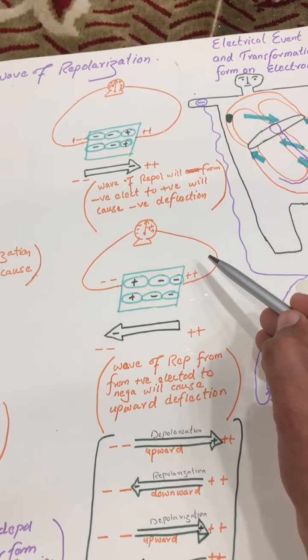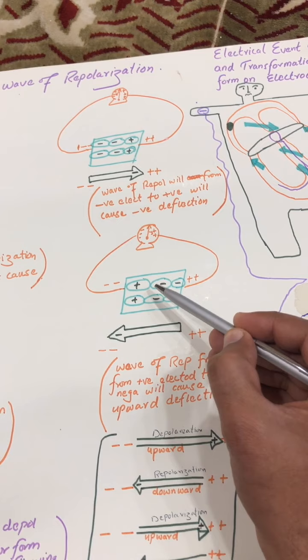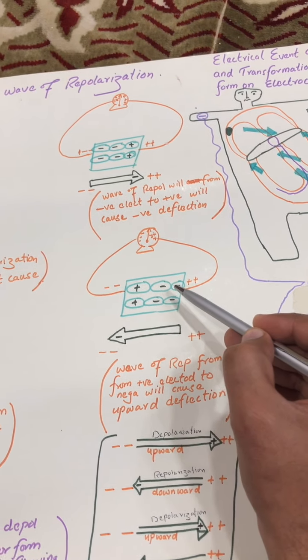Now when its repolarization occurs, the repolarization wave will start from here, and the repolarization wave, as we know, is a negative wave.